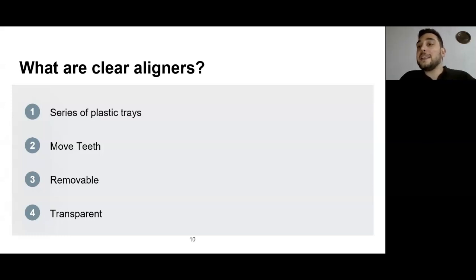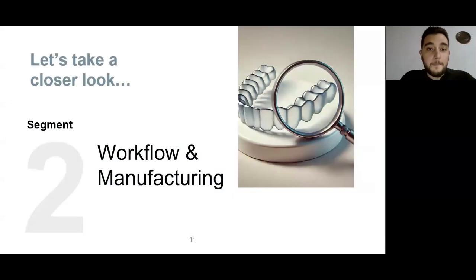It's important to note that these removable appliances should be worn at least 20 to 22 hours a day, and each tray is going to be worn for a full week. So what I usually like to tell patients is that these devices should be worn basically the whole time, except when you are going to eat and drink or clean your teeth. Otherwise, you'll need to comply and use the device almost all of the time.